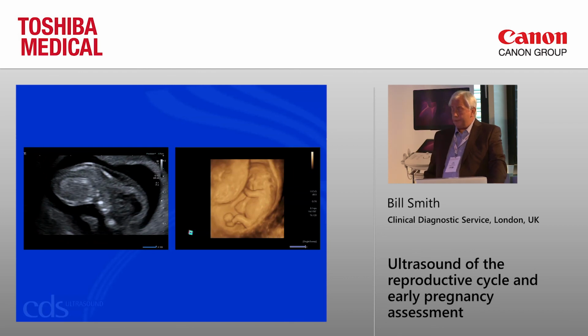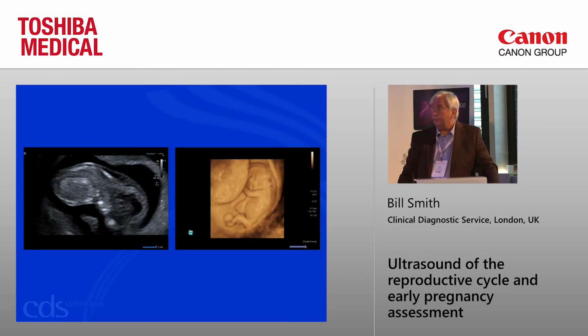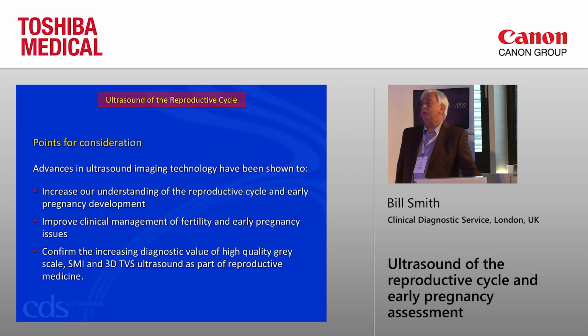This is a pregnancy at the same stage, and you can immediately see there's hygromatous change there. There's something going on in the abdomen there that we don't understand. This was found to be an omphalocele here, and increased nuchal thickness there. So we're not just looking at the early conceptus in terms of a general prognosis of a developing pregnancy, but we're getting better and better at picking up abnormalities, looking at fetal development itself in the first trimester, before 10 weeks.